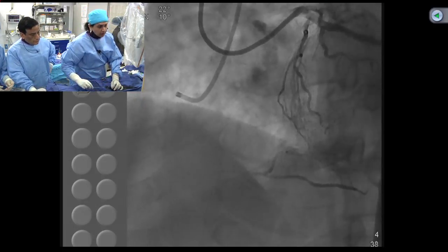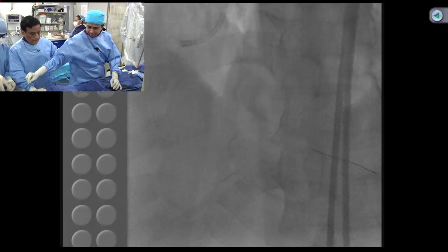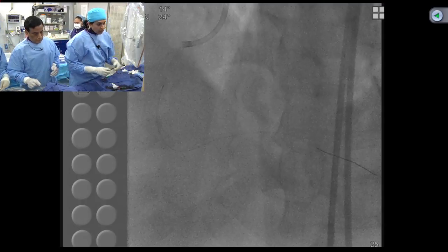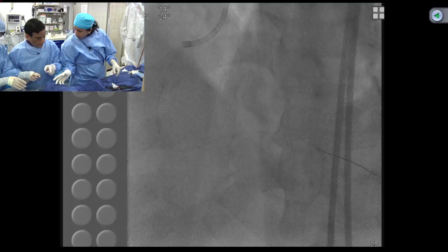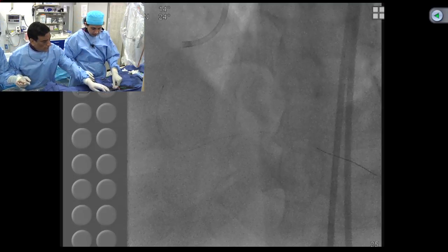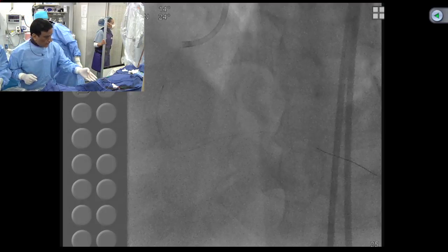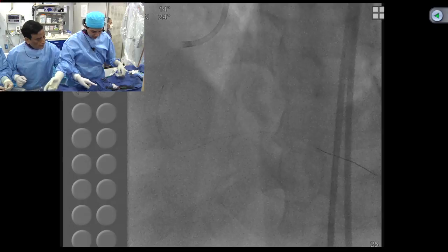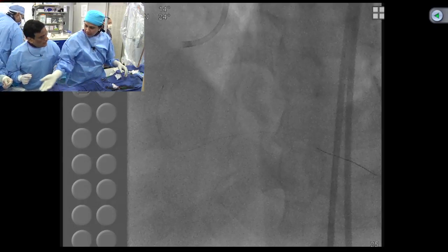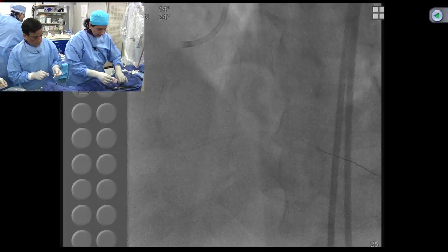Ready? Let me take it out. So you're probably looking at 3 stents, no? Around the PDA, in the mid portion, and possibly in the distal. Where is the run through? We need the run through now. I think side by side, or you have the wire there already. No, I took it off. No, you have one wire already. Yeah, this is a 300 wire. Okay, therefore let's dilate. Oh, you want to dilate that? Yeah.